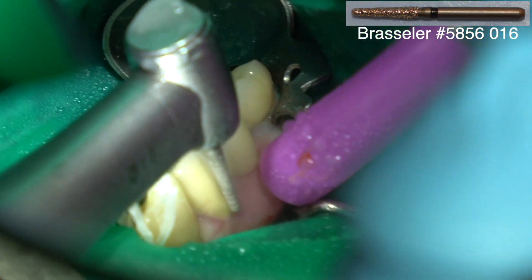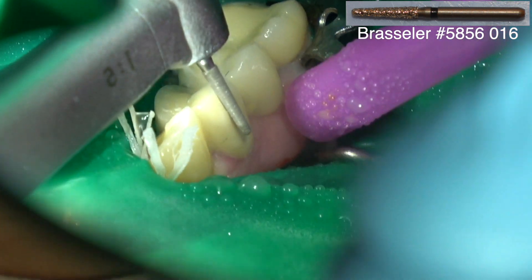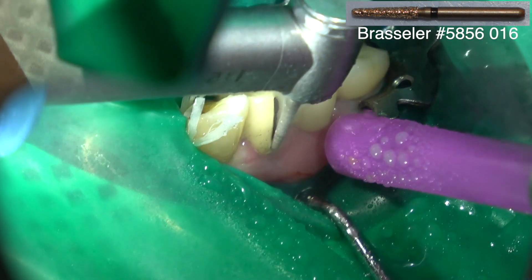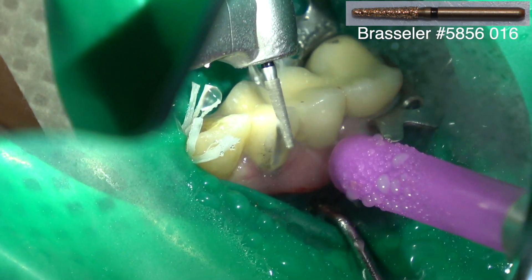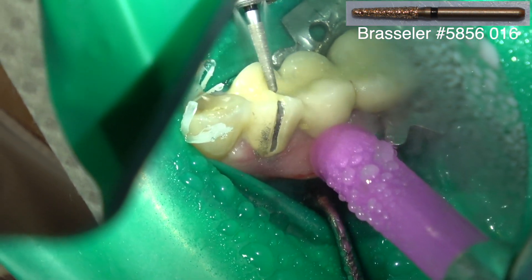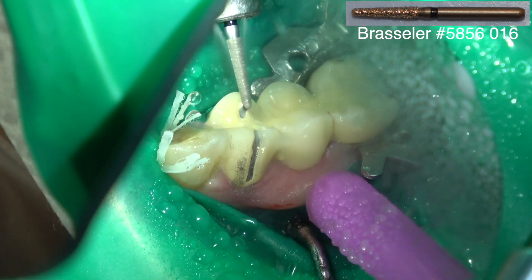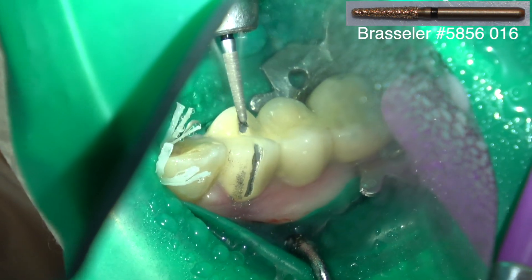The first thing we're going to do is use a coarse smaller barrel diamond, and I'm going to cut through the porcelain — or if it's lithium disilicate, Emax, or zirconium, I'm going to cut through the lithium disilicate or the zirconium.